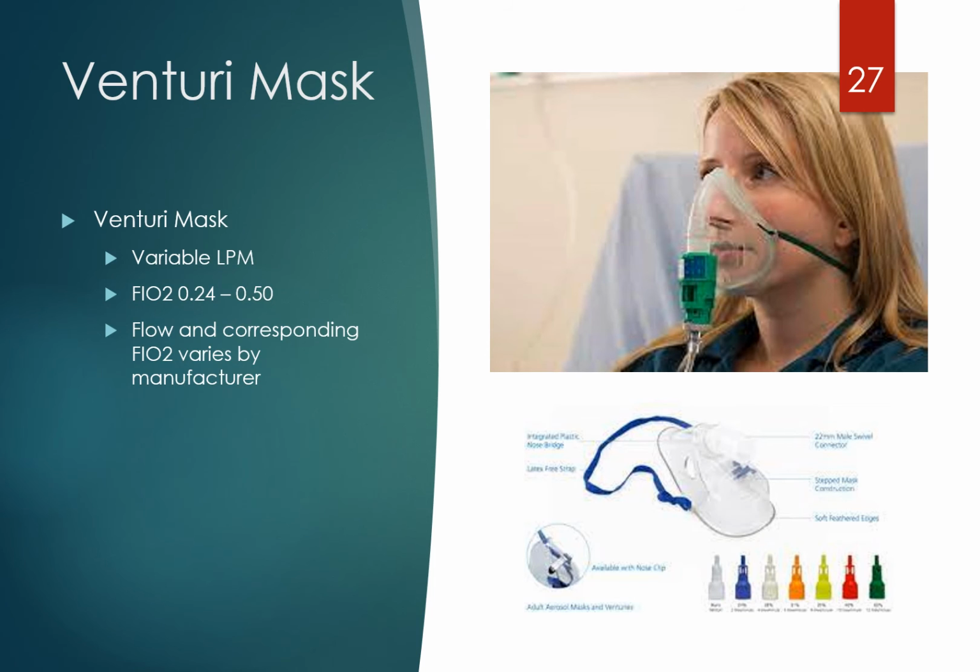So this is the Venturi mask. I wanted to give you a picture of it. And remember, I was telling you that the FiO2 delivery can be anywhere from 24 to 50%, and that could be based upon the adapter you use. You see on the bottom, you have all those adapters, the blue one, the white one, the red one, the orange one, the green one, etc. Every one of them corresponds to a different FiO2.